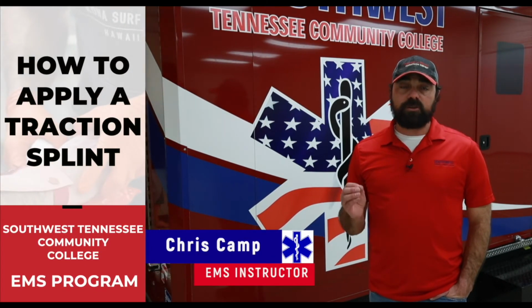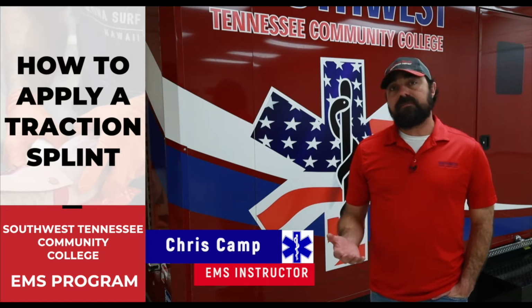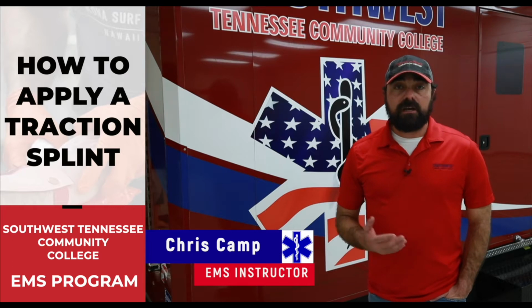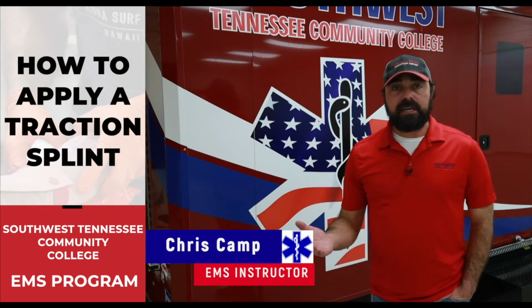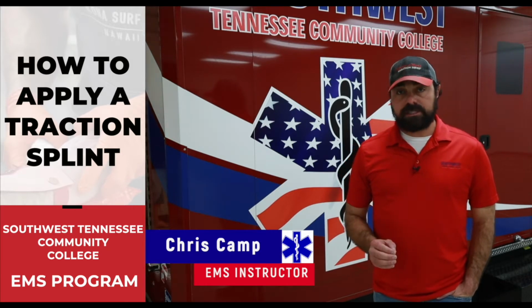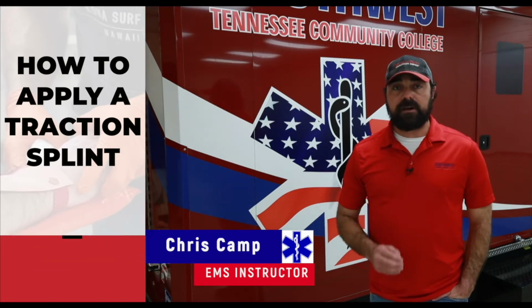Right, in this last skill that we're going to do today, I'm going to be showing you guys how to properly place a traction splint on someone. This is a device that is going to be used for somebody that has a closed femur fracture. As I demonstrate how to put this on, I'll also talk about the indications and contraindications. This is not a National Registry skill, but it is still important to know how to use the device in case you come upon it out in the field.